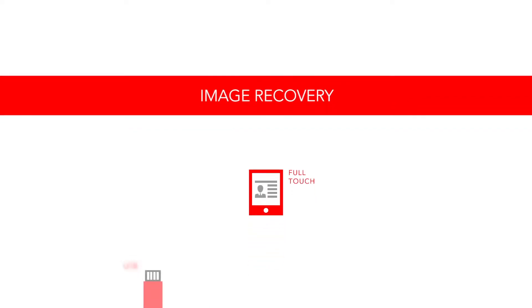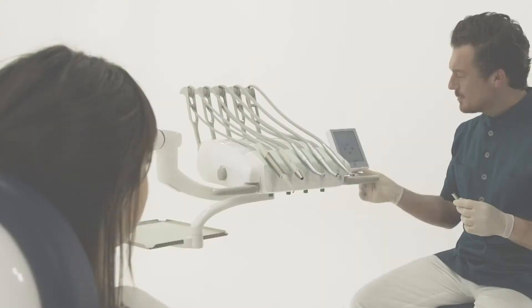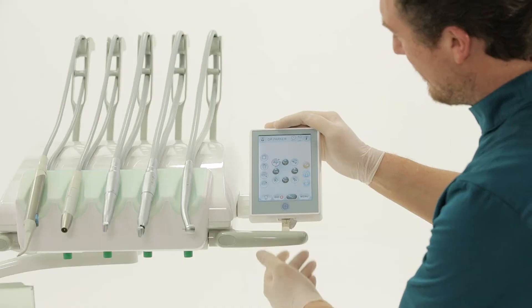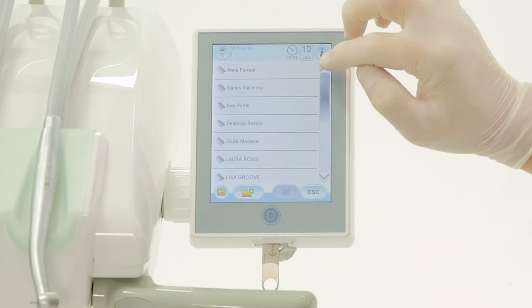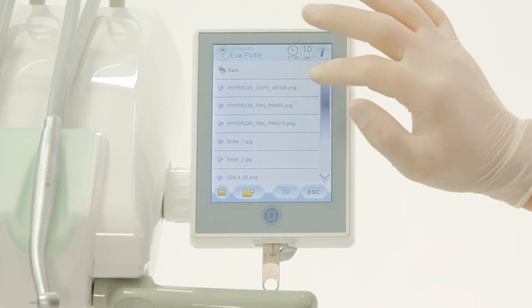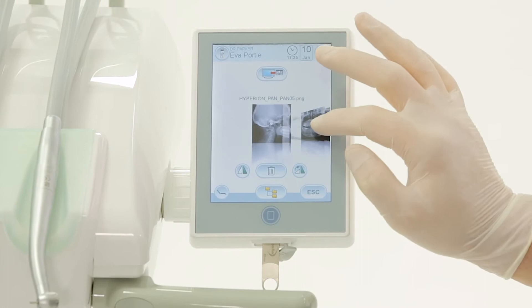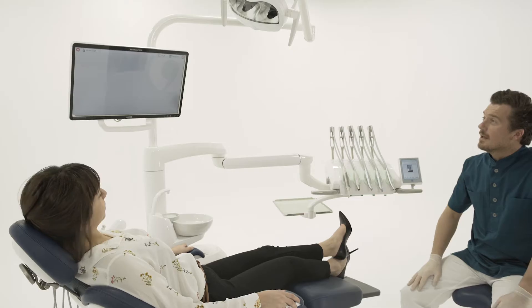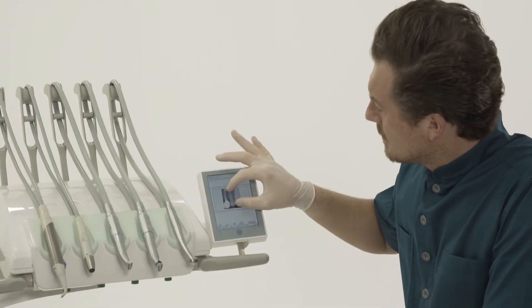The image log of every patient can be retrieved instantly. With a USB flash drive, the available images are displayed automatically. With a single click, the same image can be viewed simultaneously on the integrated monitor.